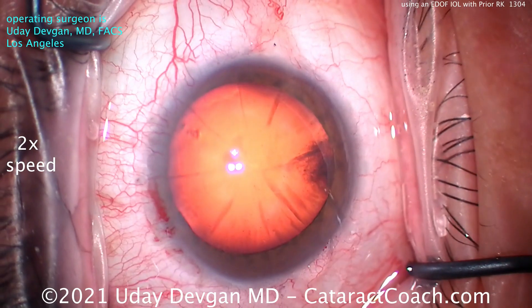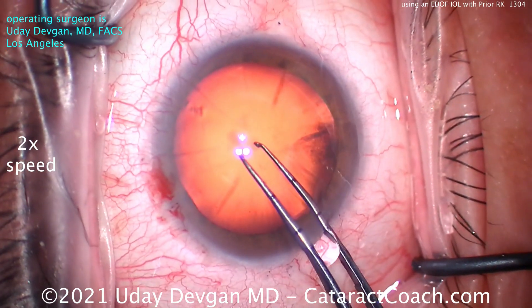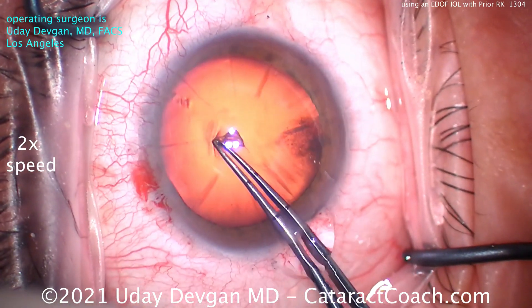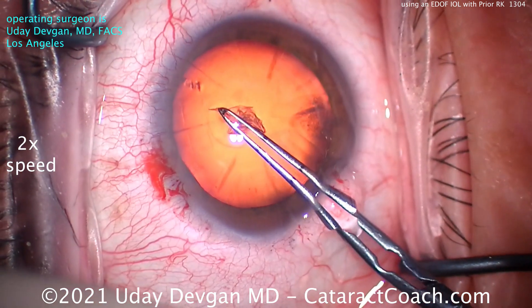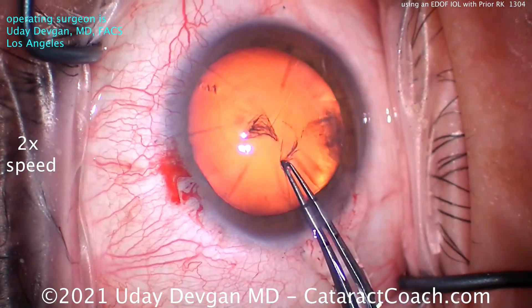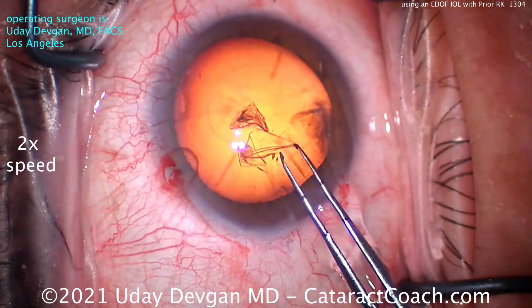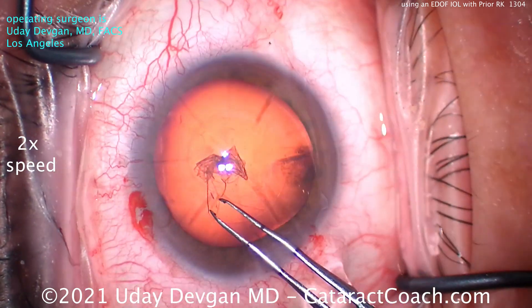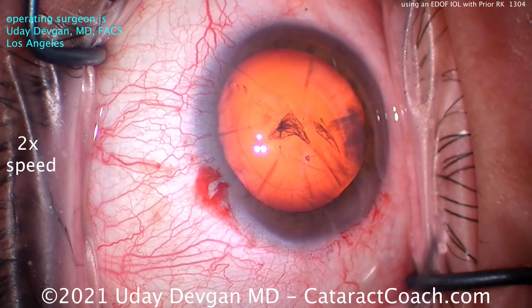If you go back, you've seen a video of me saying that I probably wouldn't put these EDOF IOLs in patients who have prior corneal refractive surgery where the cornea is distorted — like an RK or a high degree of myopic treatment — because I wanted to maximize image quality at the one focal point.